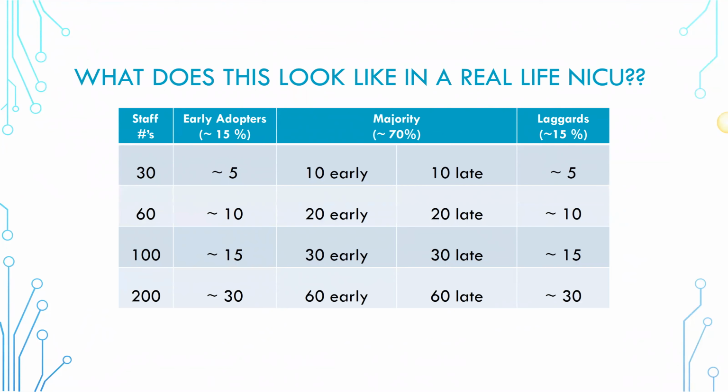We know those babies are very at risk for subclinical seizures, especially with meningitis and sepsis. But of course, you can use it for spot checking, for maturation, and even impact of some developmental interventions. So this laundry list can be pretty overwhelming, but this is to say that there's not really any excuse not to be using your device on any specific day. It's just a matter of developing the culture to do so.